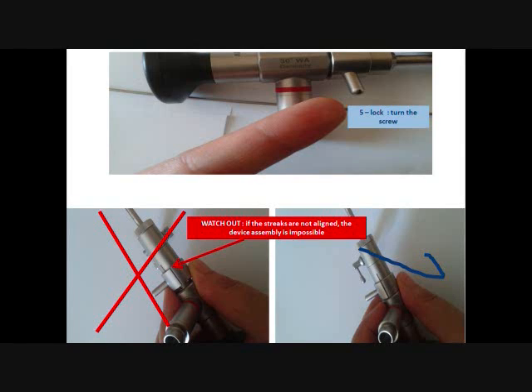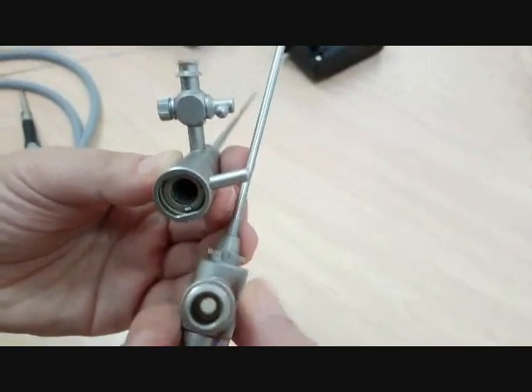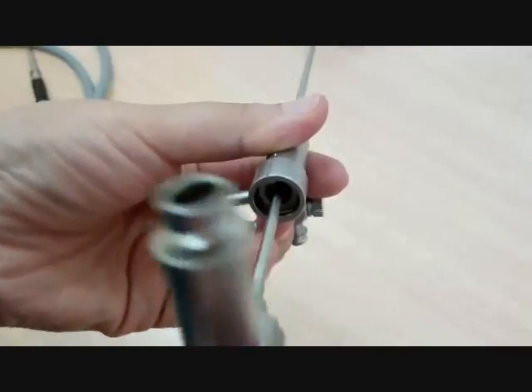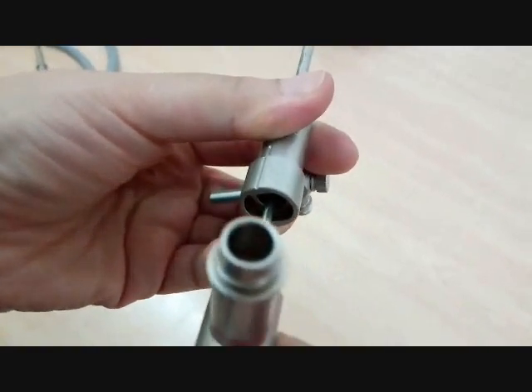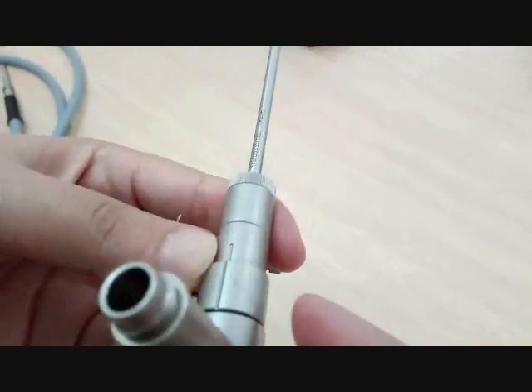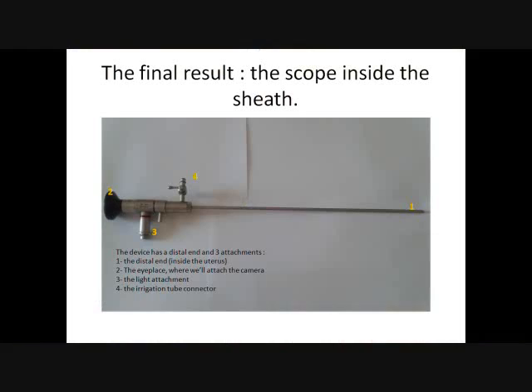You want a little video for the demonstration? So there we go. The bump on the sheath and the little notch on the scope. We insert the scope inside the sheath carefully, and then we put the bump against the notch, like that. We lock. It doesn't fall. And the final result, we have a scope inside the sheath with a distal end, number 1, and 3 attachments indicated by number 2, 3, and 4.